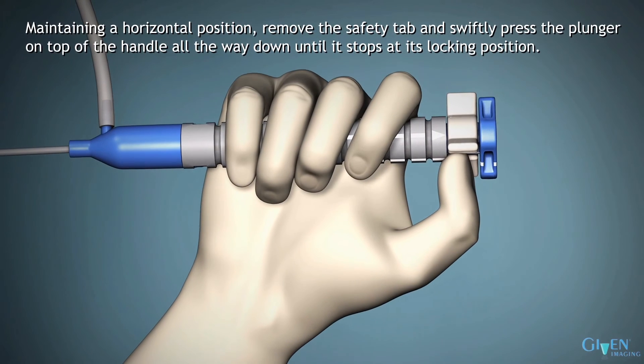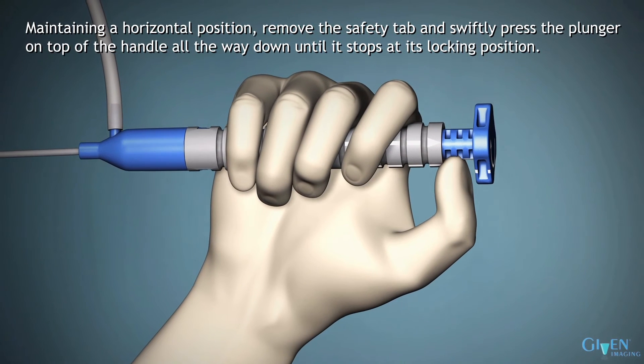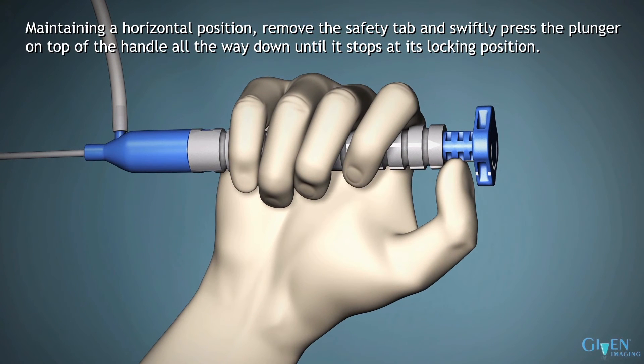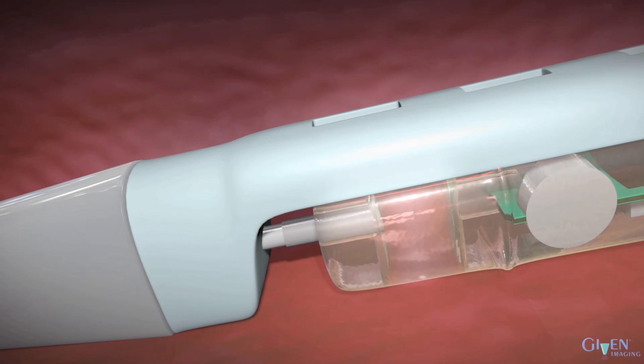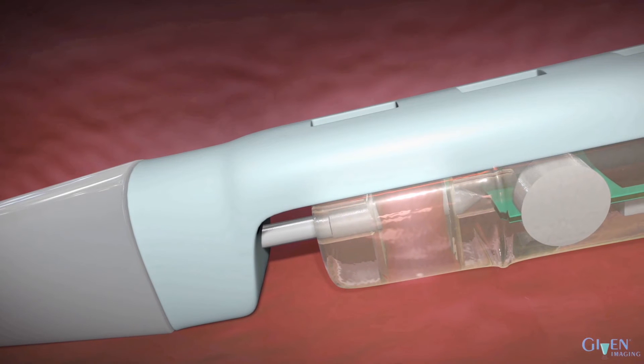Maintaining a horizontal position, remove the safety tab and swiftly press the plunger on top of the handle all the way down until it stops at its locking position. This advances the trocar needle into the suction chamber.